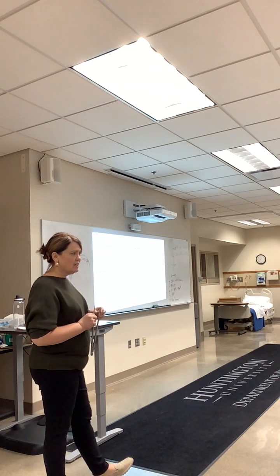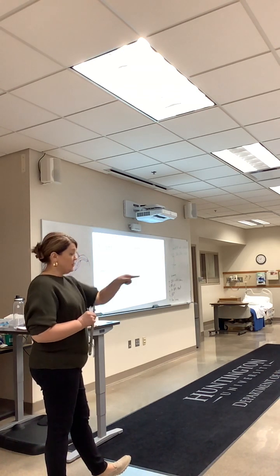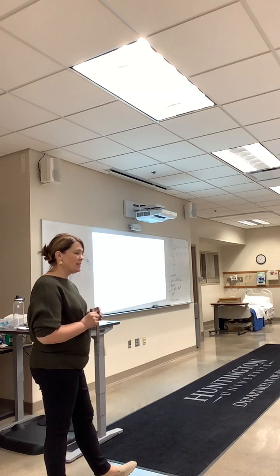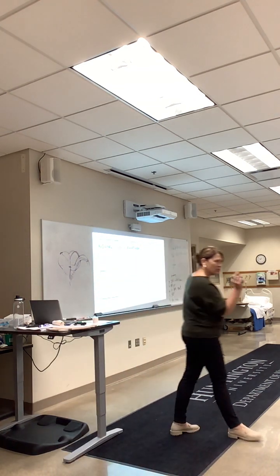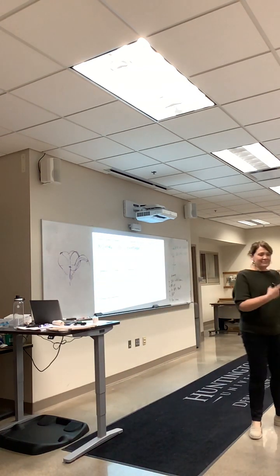You can click and drag and rotate the distance, if you have the computer access to it, absolutely. Okay. Click and drag and check it. That's nice. Usually, you get to the point where you can just look, you're like, oh yeah, that's 2 boxes. Okay.